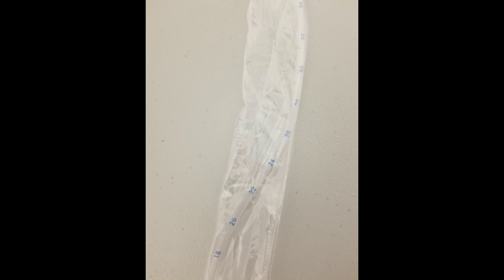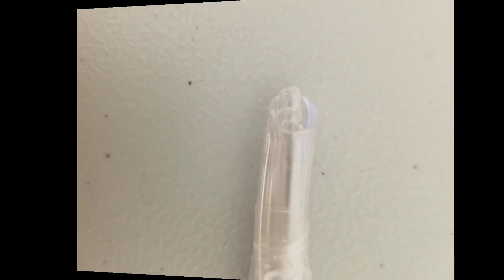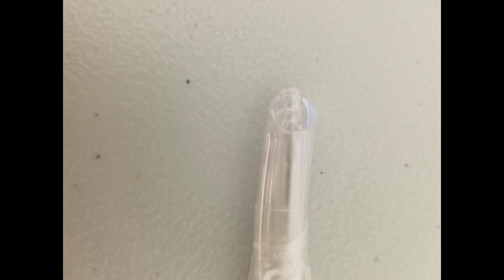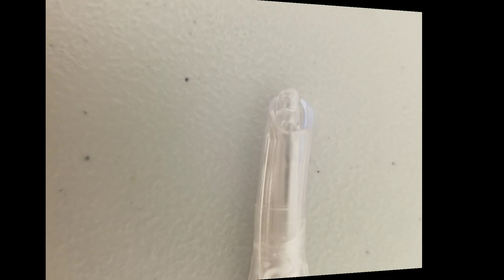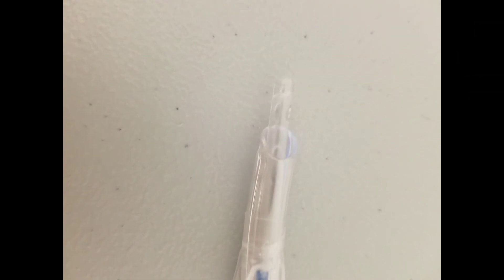So when the 26 on the catheter and the ET tube line up, that means the suction catheter is just at the distal tip of the endotracheal tube. If you push it one centimeter further — so you have 27 centimeters of the inline suction catheter lined up with 26 centimeters on the ET tube — that means it's going to be one centimeter past the distal tip of the ET tube.